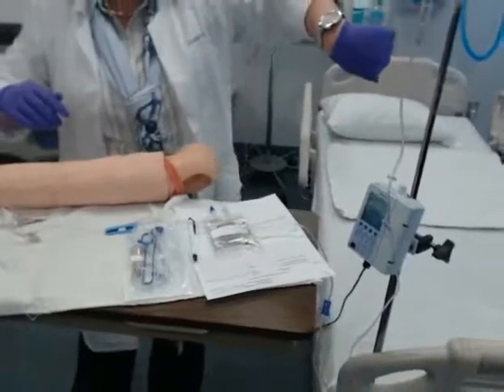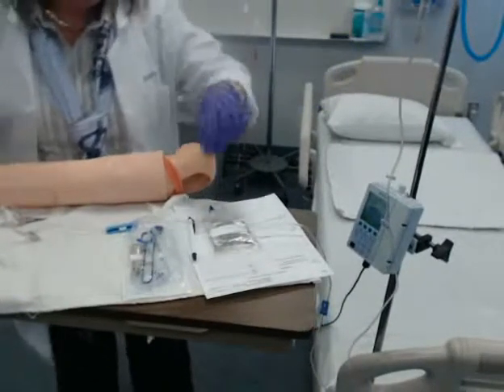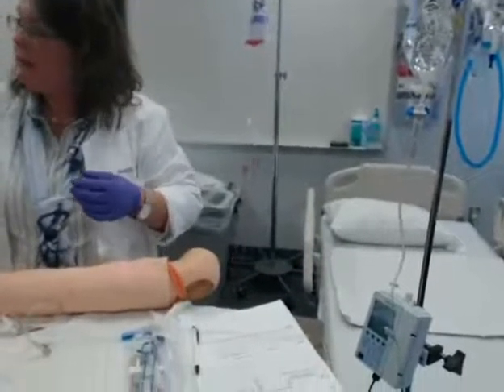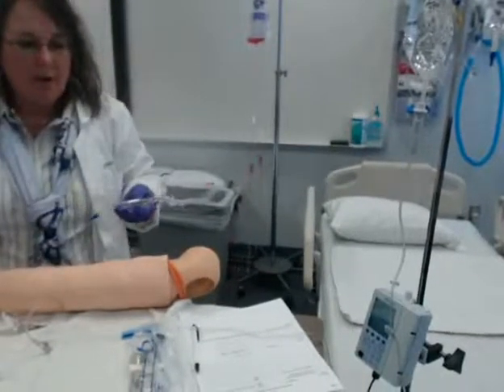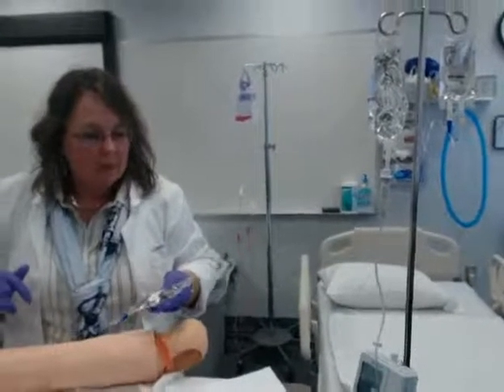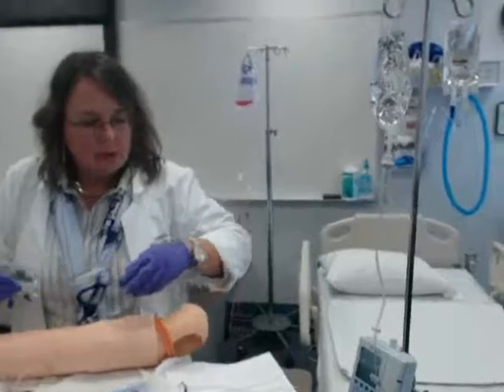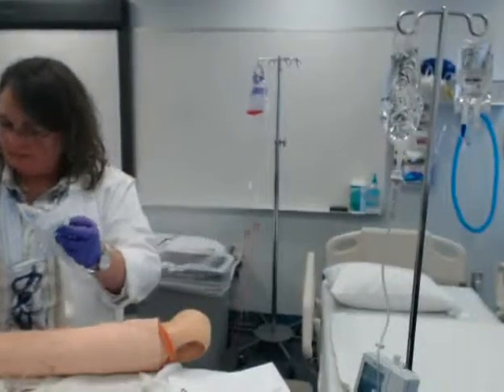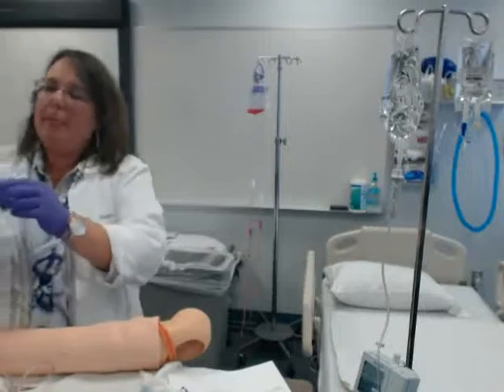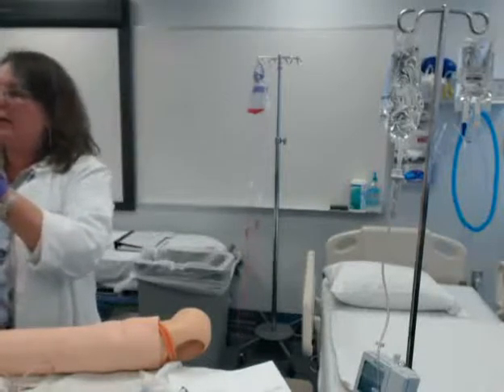I'm going to set my pump — you guys don't have to worry about pumps yet. We're going to let you play with them in clinical; we'll talk about it in a couple of weeks. For my normal saline over 6 hours, I'm setting that at 83 mL per hour. So that's going — it's infusing. I'm going to open my clamp.